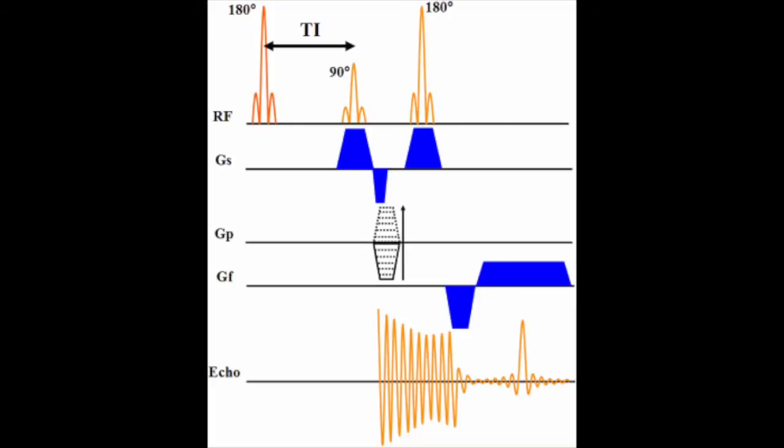On the other hand, inversion recovery includes a 180-degree RF pulse followed by a 90-degree RF pulse excitation couples. And by adjusting the TI value according to water's T1, because that's the material we want to suppress, this sequence can provide water suppression in the image. For example, using the FLAIR sequence, TI must be selected as about 2000 milliseconds to provide water suppression according to requirements.